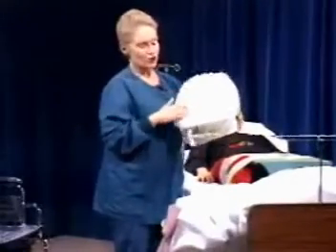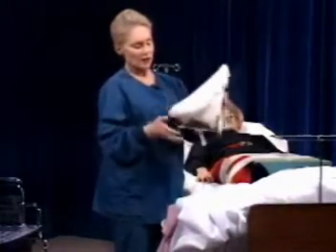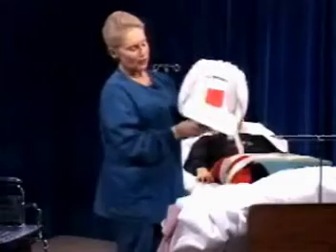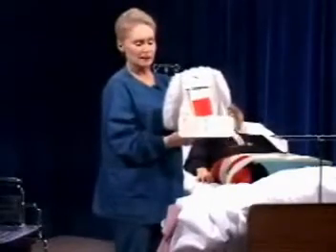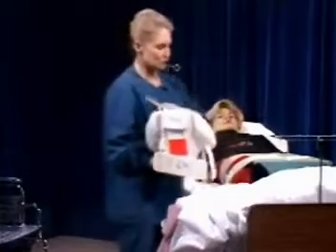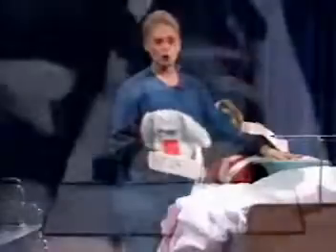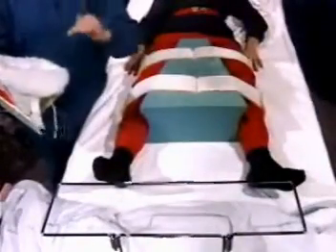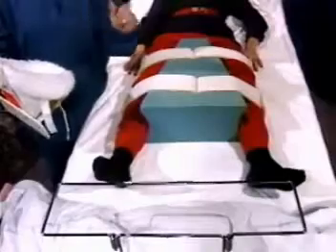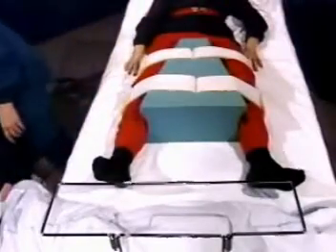It's made with a sheepskin type of material that's very soft and cushioning to the patient. And this particular bunny boot has some lateral supports which prevent the patient's hip from rotating side to side. Often a bunny boot, or as we shall see, a heel suspension boot, is used in harmony with the wedge, because as the patient is immobilized virtually by the wedge, there's a constant pressure put on the heels. So let's turn our attention to a heel suspension boot.